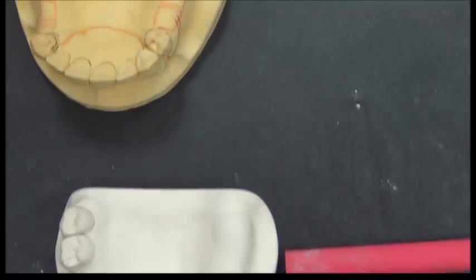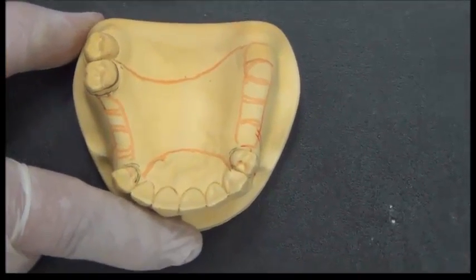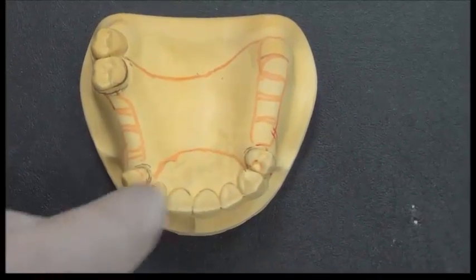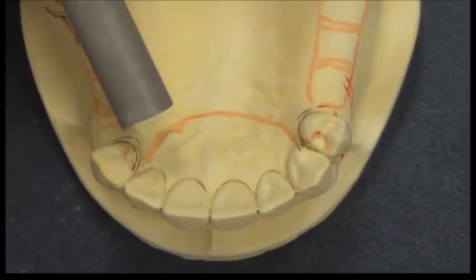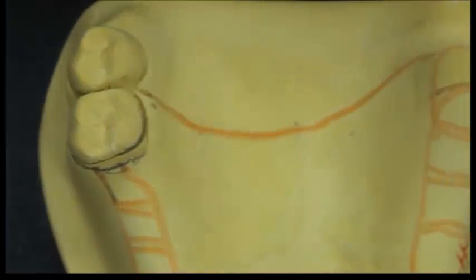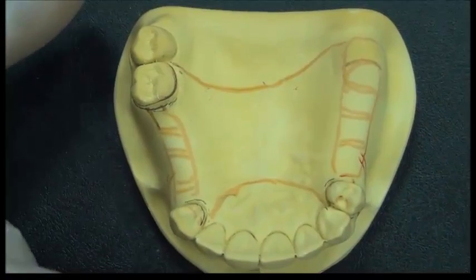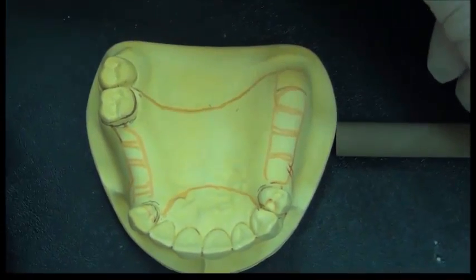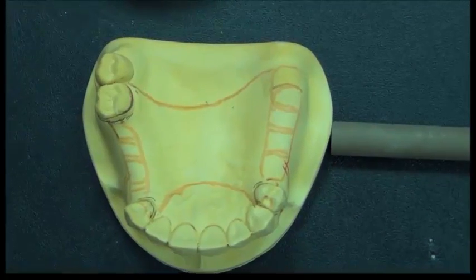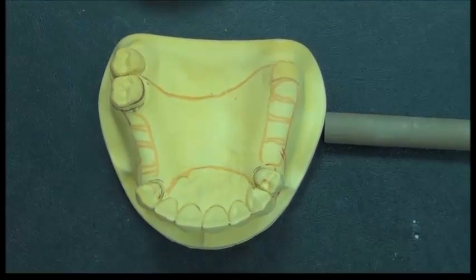In the second lab, we should have designed our RPD, and we do what we call tooth preparations. In this case, we can see that there's a rest prepared here, a rest prepared here, a rest prepared on this side, and we have done some adjustments inside the patient's mouth. And we take another impression. We do a second survey, which we call the final survey, and by it, we draw the design for the RPD that we're going to do.